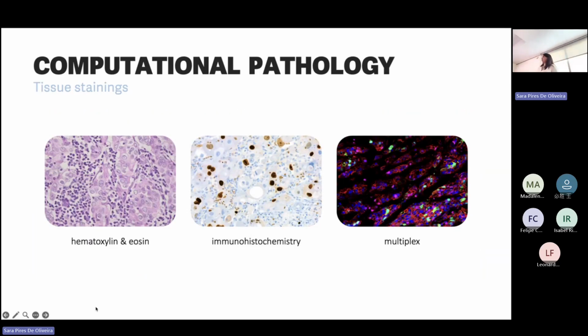And what do our images look like? Well, basically like this. You have pink images, then blue, and then these black and really bright images. Starting with the hematoxylin and eosin. As I said before, this is the standard staining that we have in the lab. They use a combination of these two reagents, hematoxylin and eosin. The hematoxylin highlights the nuclei because it binds to the DNA, so it turns the nuclei purple. And the other one binds to other proteins in the cells, and so it dyes all the other structures pink, and so we have this contrast.